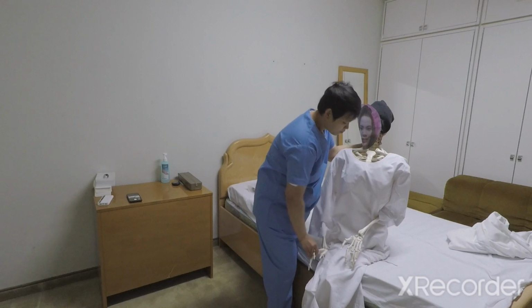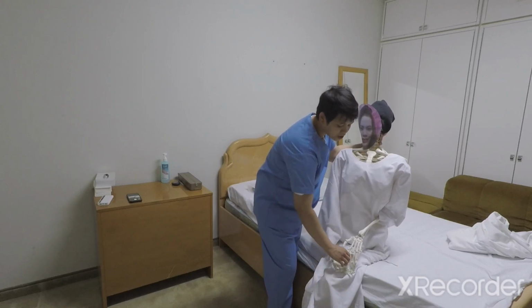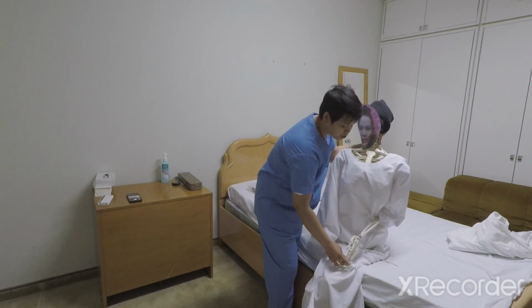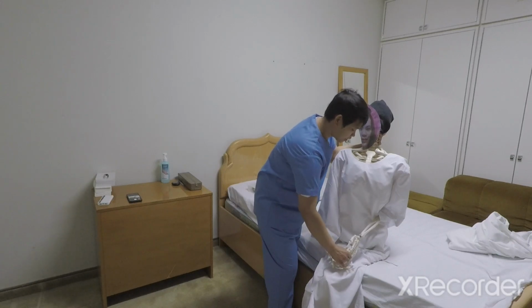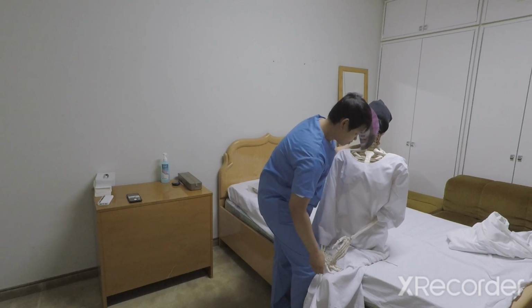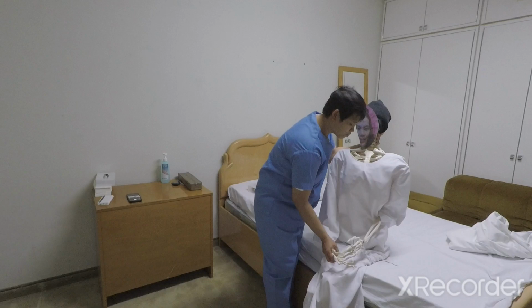As physiotherapists, we transfer patients by asking them to lock both hands. Let's lock her both hands. It's going to be easy for you if the patient could help you. If it's a stroke patient, they have to do it this way.